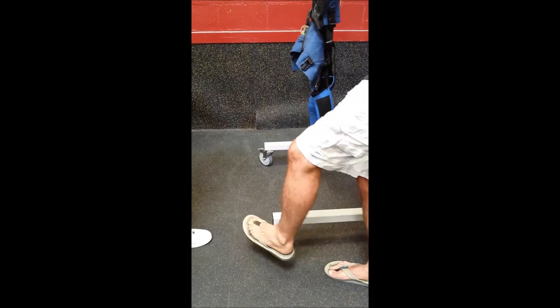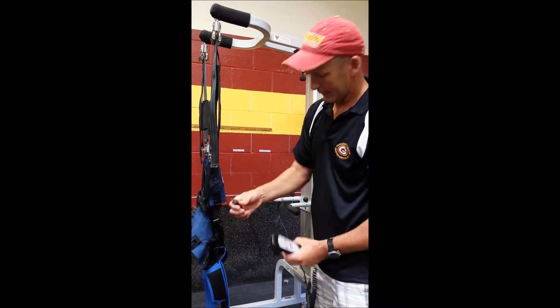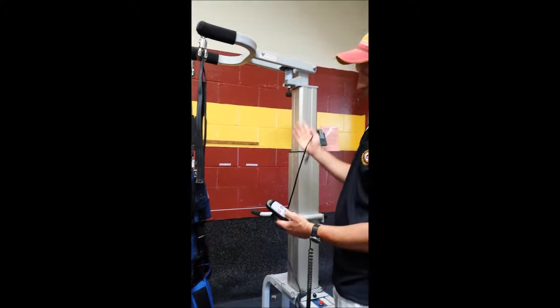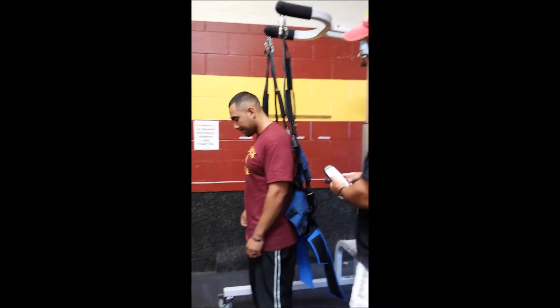The brakes are down here, so when they switch out the brakes are on. When you plug this in, it charges the battery. In order to operate it up and down, I have to unplug it and stand in here as if we were going to fasten you in.